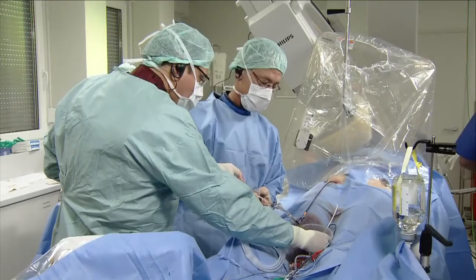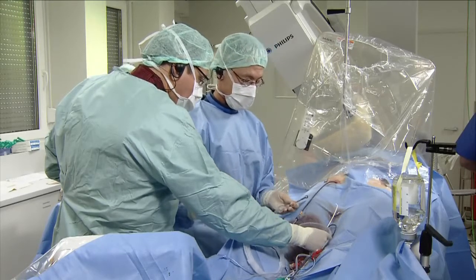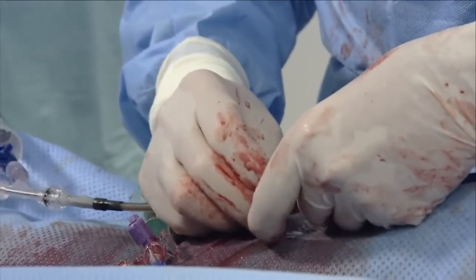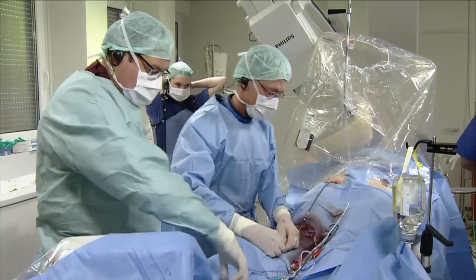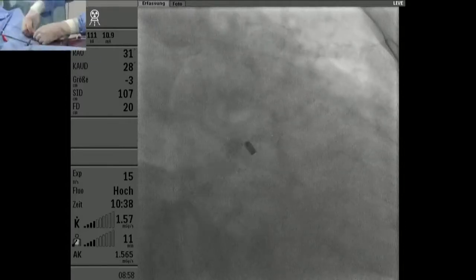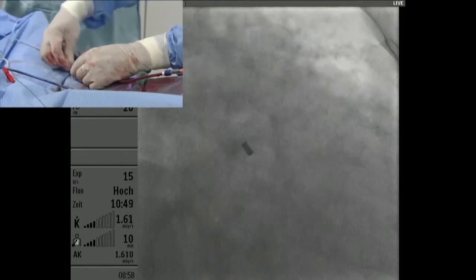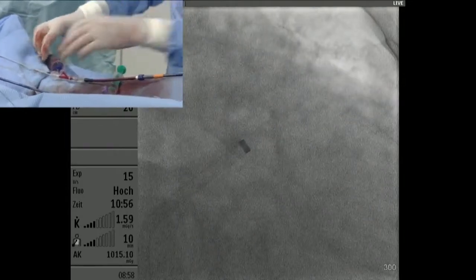J1, any thoughts? I think you came in a bit late. But I totally agree with the proceedings now, because 25 is too big, and you have to go to the superior lobe, because behind the neck, just at the moment of separation of these two lobes, there's a strong anterior angulation of the appendage, which resulted in flop out over the circumflex artery. I think this is a good option to try 18. Okay. And hoping that the disc is big enough. Otherwise, I think Lifetech would be a good option.